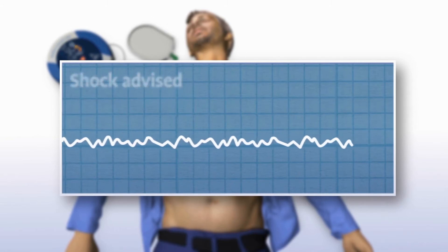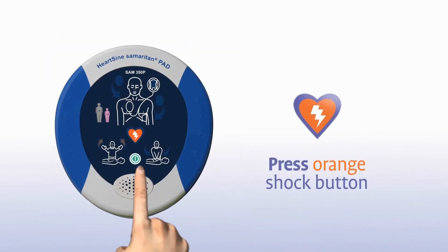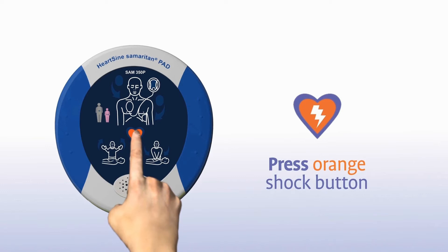If a shock is needed, you will hear: 'Shock advised. Stand clear of patient. Press the orange shock button now.' Once you press it, the device confirms: 'Shock delivered.'